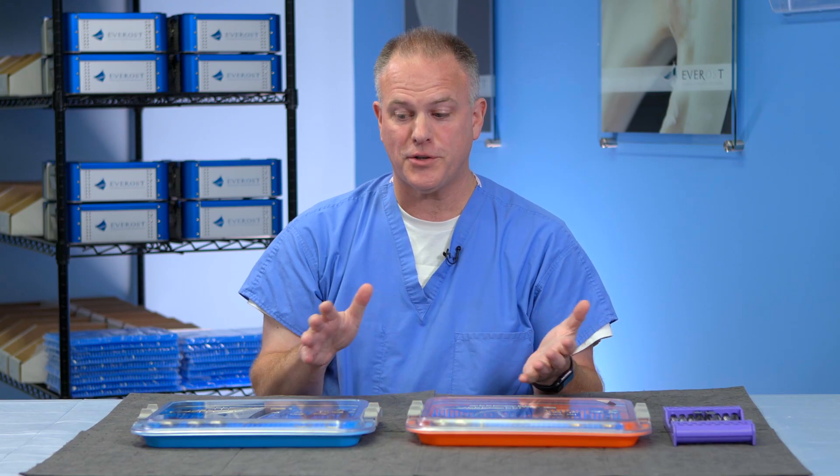I'm very excited to introduce this new line of oral surgical instruments. They come out of over 20 years of my own personal experience on properly extracting dog and cat teeth.